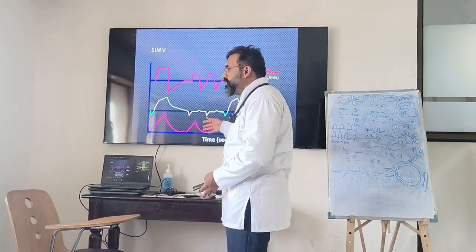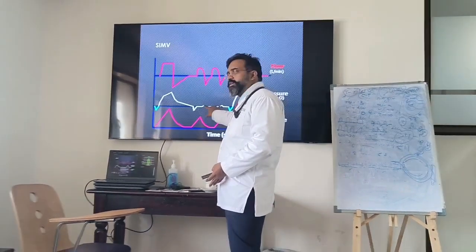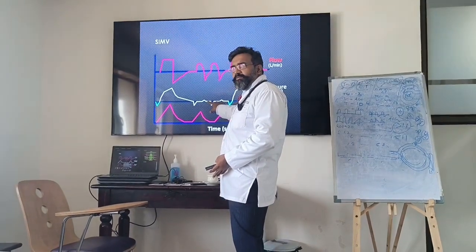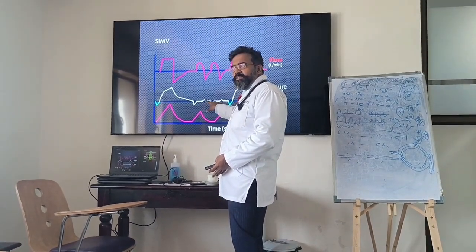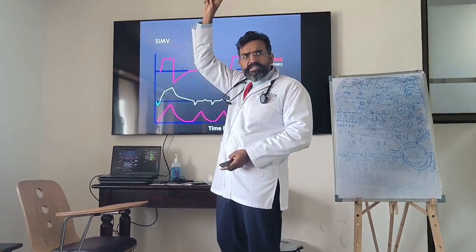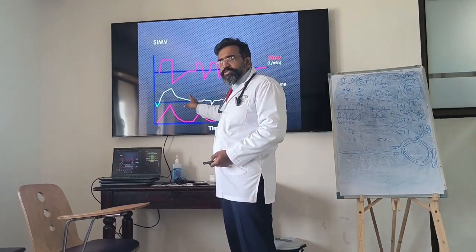Completely spontaneous breath. That's why you are having a sinusoidal pattern where it goes down and tries to come up. We said spontaneous breath is negative and then comes out, like we saw in the first graph. So this is spontaneous. Clear?